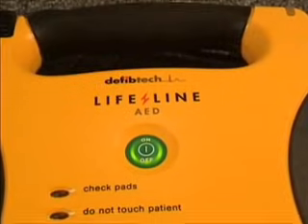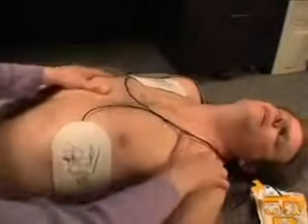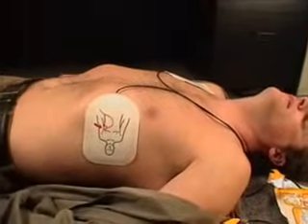The unit will not analyze the victim's heart rhythm if it detects the victim is being moved. Stop motion and do not touch the victim if so instructed.